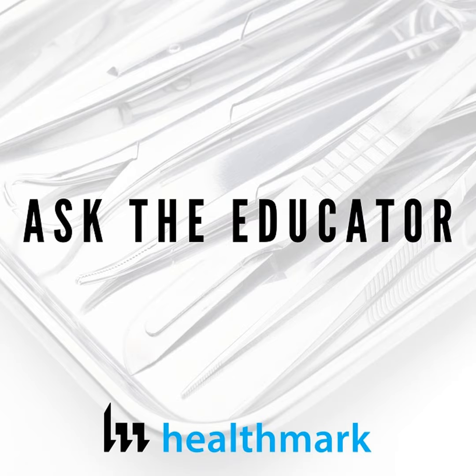And what we find consistently is that staff will always do whatever they have to do to get the availability goal. The goal is to make it available. The problem is that if it's not functional or if it's not safe, it means they took shortcuts. I was in a hospital just recently and watched them process Da Vinci robot arms. Watching the guy, there's no soak, there's no flush.